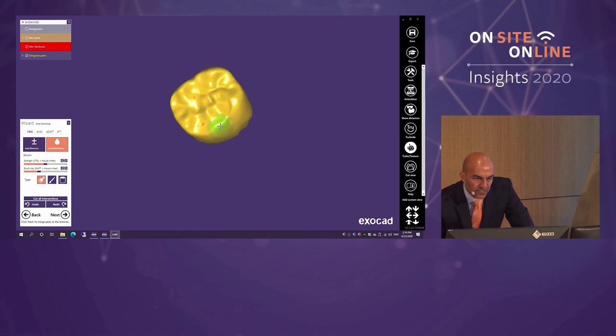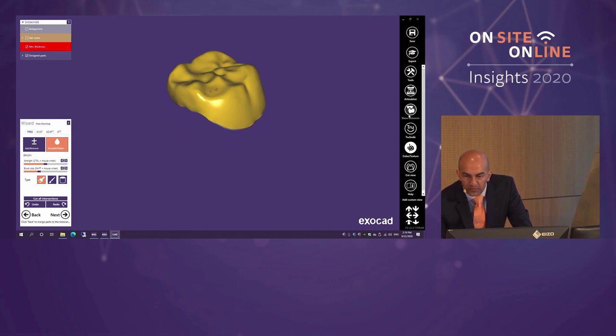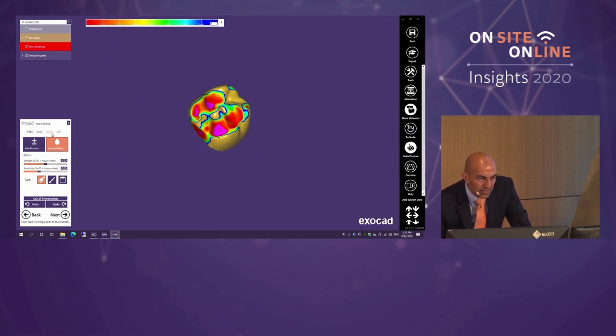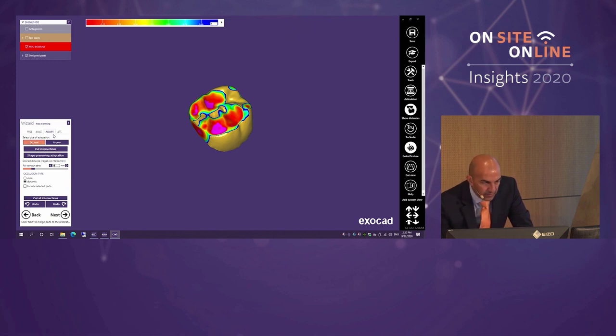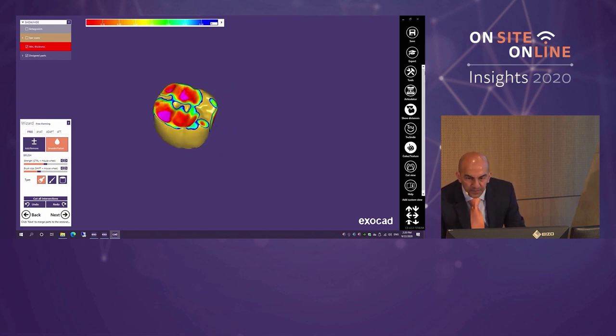I've made some adjustments and you can see pink areas where the software is warning me I'm encroaching on minimal thickness — it's constantly preventing mistakes. Bringing colors back in shows tight contacts and occlusion slightly high. There's an automatic tool to fix that: under Adapt, setting the parameter to zero and asking it to cut intersections drops the occlusion down. Likewise for approximals, it cuts intersections and adjusts that for you. I'll fine-tune a little more using Add/Remove to clear the high points before milling.